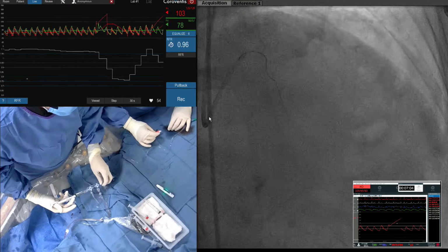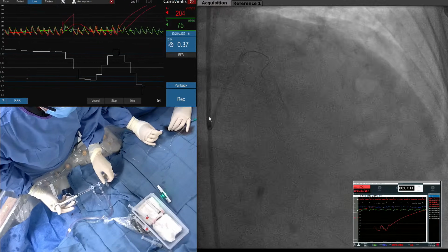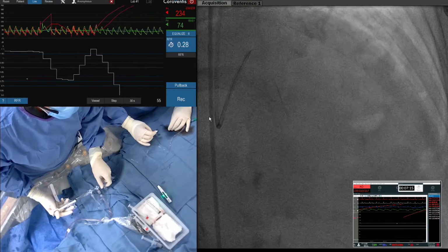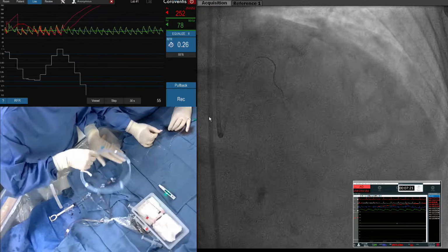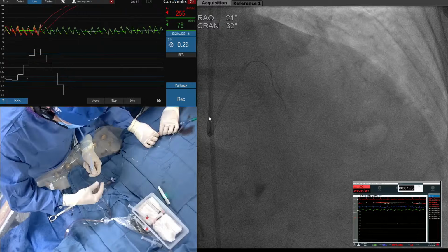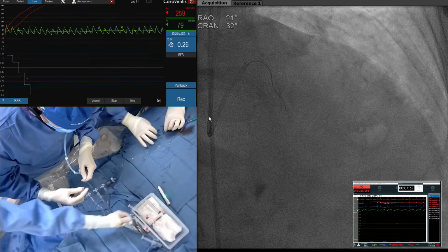I see that you've switched the CoroFlow to RFR, which is an epicardial index, a non-hyperemic pressure ratio. Do you measure that in every patient? We do. The more data we get, the better we feel we're prepped. Here, let's go with the run through. You might need more. You need another wire introducer? Yep. There you go. Thank you.